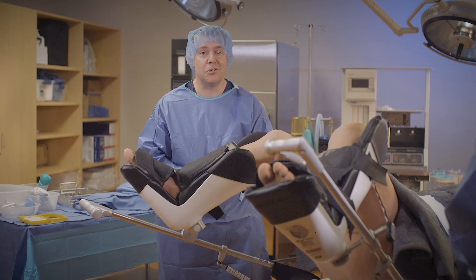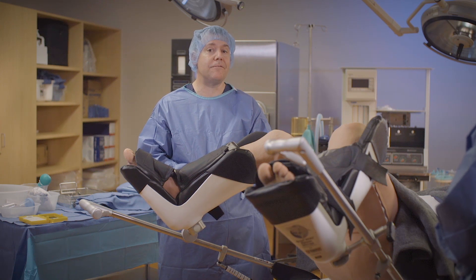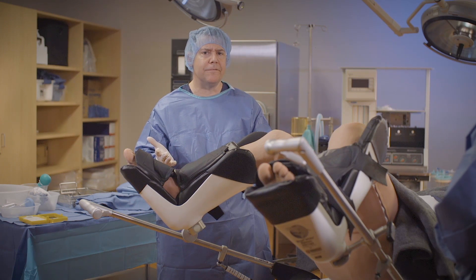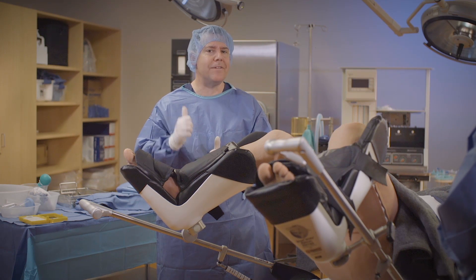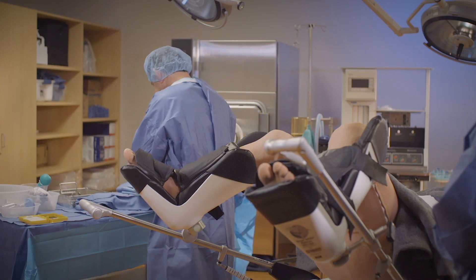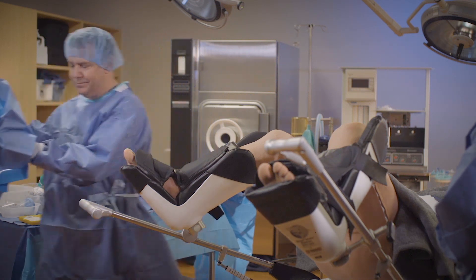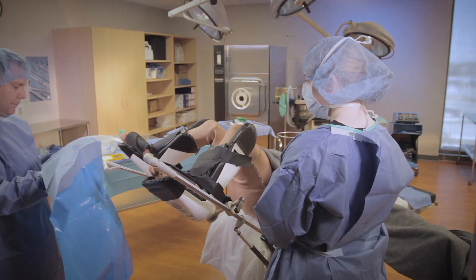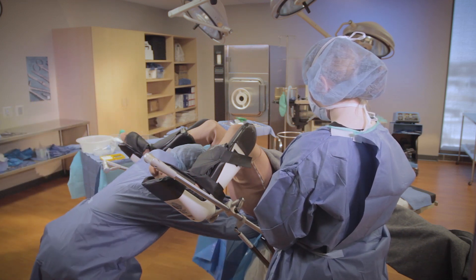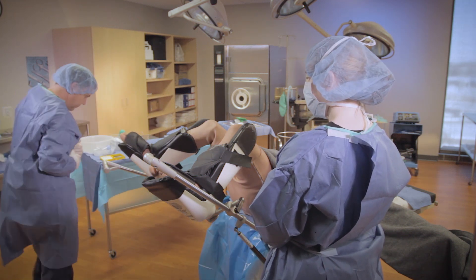Manufacturers continue to do a great job by telling us where to place our hands. With my hands underneath the cuff of the under buttock drape, I'm going to place the drape completely under the buttocks so that only the cuff is barely visible underneath the patient. I'm going to be very careful not to contaminate my sleeves on the stirrups. The drape says left hand and right hand — how amazing is that? I'm going to let the drape fall, and carefully push it under the patient.